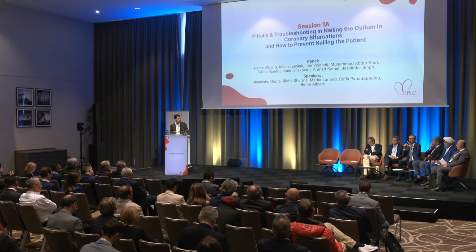It was developed in 2005 for angulated lesions like left main, and when there is a lot of motion. What does a lot of motion mean? When you have more than 2-3 millimeters of to-and-fro motion of the stent. When you have no motion, sometimes you can do it with a wire, you have the marker wire, etc. But when there is a lot of motion, the SABO technique was something that stopped the motion. So this is the only reason.